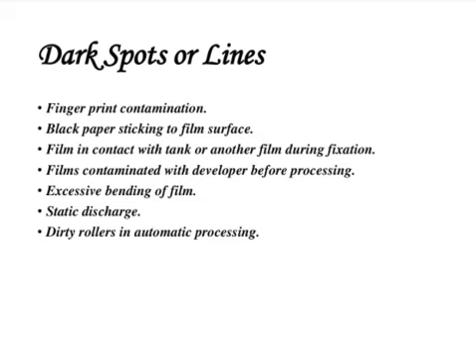It is most commonly seen with extraorals because when you pull out the extraoral film suddenly, you can see the static discharge. Also, dirty automatic rollers, which have not been cleaned or maintained for a month or more, start getting dirty because they're continuously moving, and the developer and the fixer get deposited in these areas. So these are the reasons for the dark spots or lines.